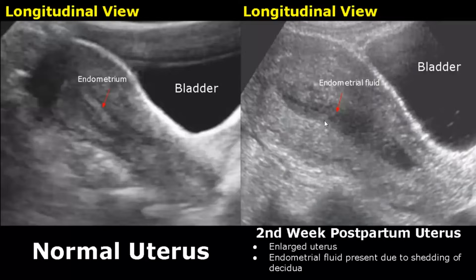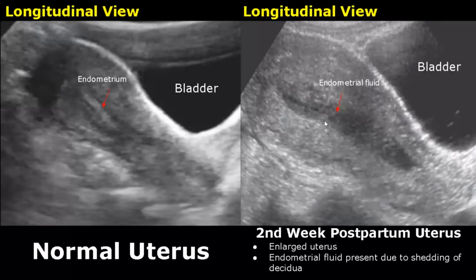This image is of a second-week postpartum uterus taken at eight days after delivery. It has decreased in size compared to earlier stages, but is still enlarged. Some endometrial fluid is present — this hypoechoic area is fluid due to shedding of the decidua, and it is a normal finding on ultrasound.